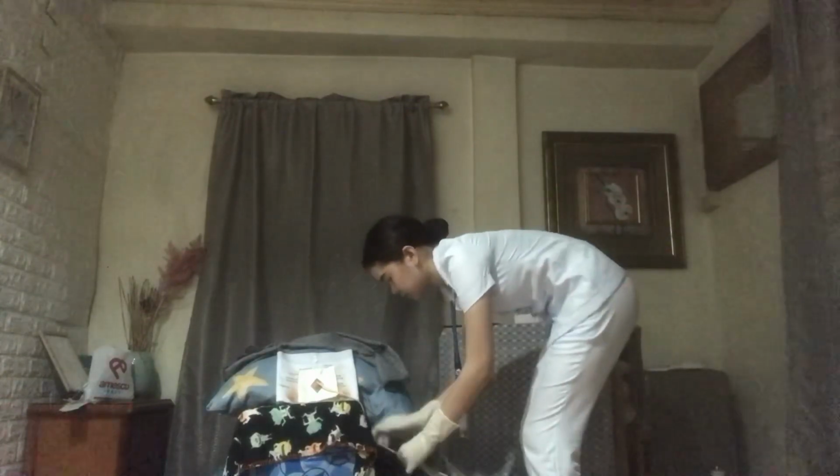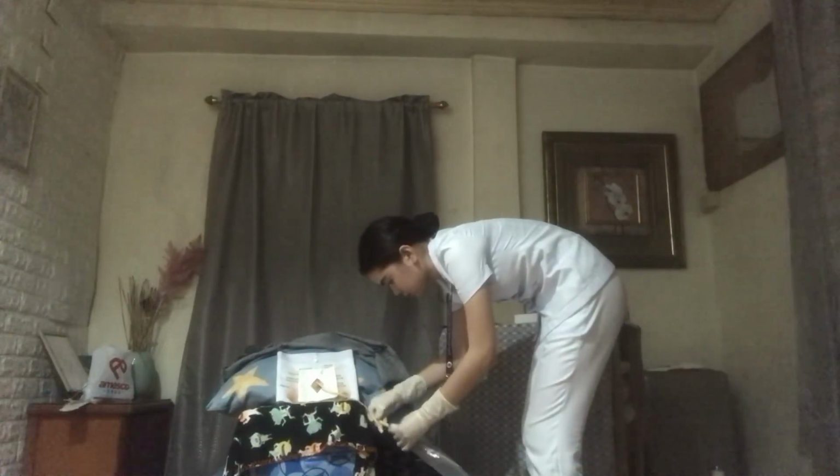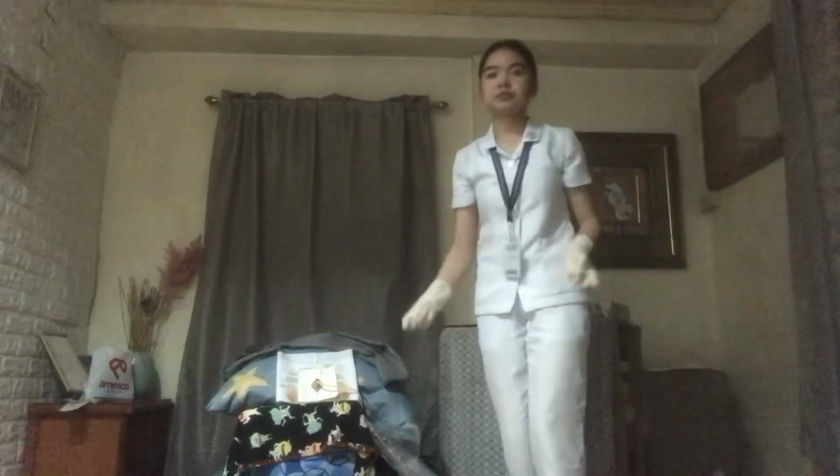Now, rest the hand on the pubis area while holding the catheter in place to prevent pulling and pushing of the catheter. Withdrawing the catheter and pushing it back in the urethra increases the possibility of contamination of the urethra. Now, after that is to connect the catheter to the urine bag. Now, inflate the balloon with 10 to 15 cc of sterile water using a 15 to 20 cc syringe.